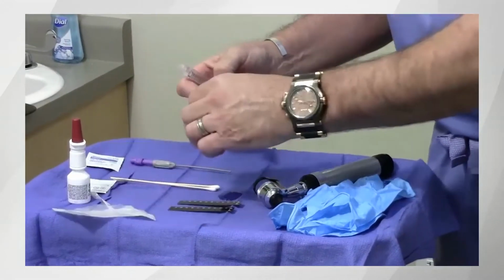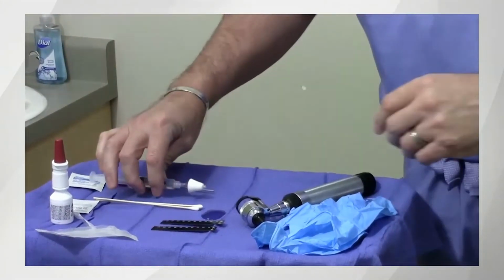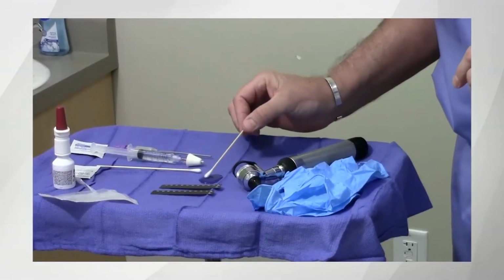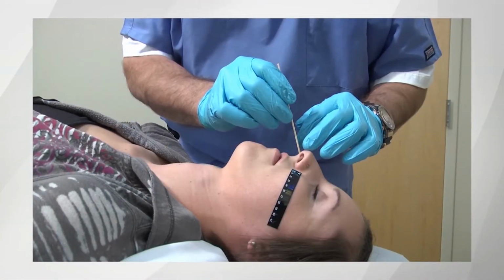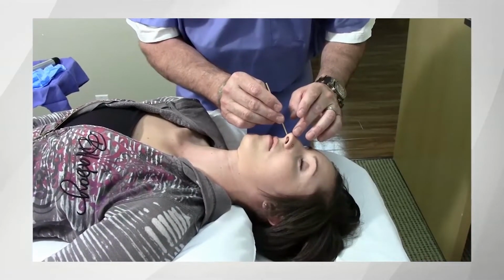block. Lidocaine gel should be used to lubricate the catheter prior to insertion into both nostrils. For patients with sensitive nasal mucosa, pre-medication with 2 or 3 gentle passes per side using a cotton-tipped pledget soaked in viscous lidocaine can be very helpful. It allows the practitioner to feel the course and provides effective lubrication and anesthesia. In patients with obstructive anatomy or congestion, atomized lidocaine or Afrin might be an appropriate pre-treatment as well.